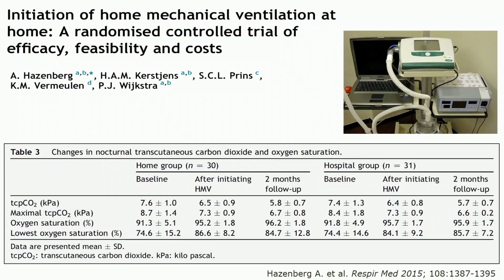I'd like also to point to the Dutch group. The Dutch group, you may know, is very eager in doing outpatient establishment of home mechanical ventilation, outpatient control. They do a great job. And what they did in that study is use transcutaneous monitoring in the home environment. And it's clear if we go outside the hospital, we need to be as non-invasive as possible.